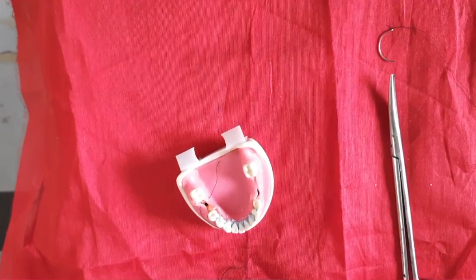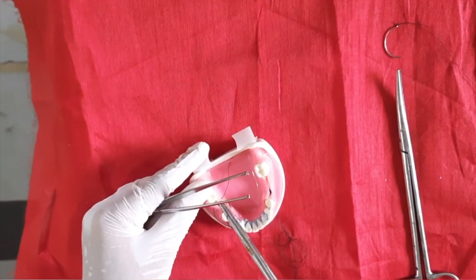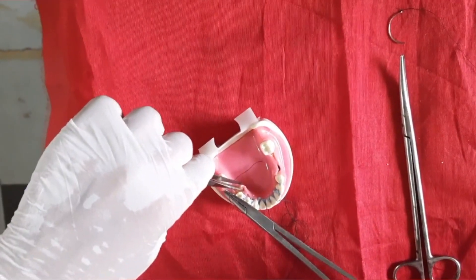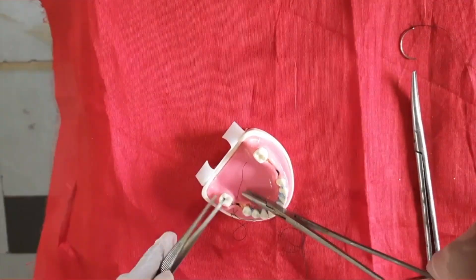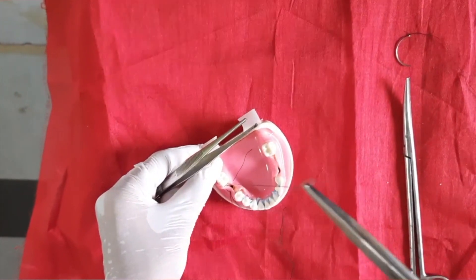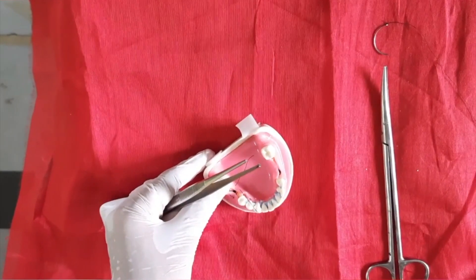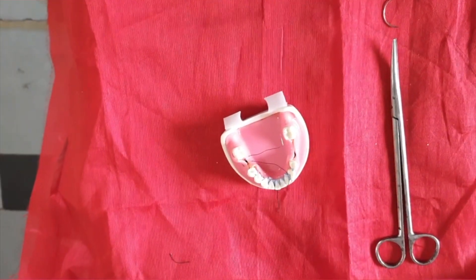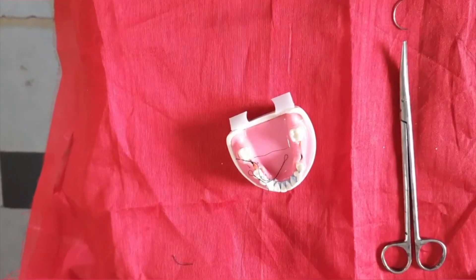For the second pass, hold the needle in the needle holder properly, then enter it and bring it out from the other side. This pass should be shallow, not deep inside the tissue. Pull the whole thread. Now we are going to make the knot — the knot should be on one side only, either this side or the other side.